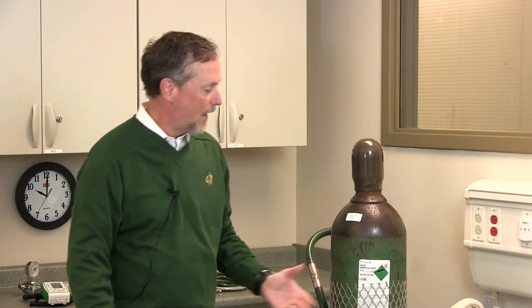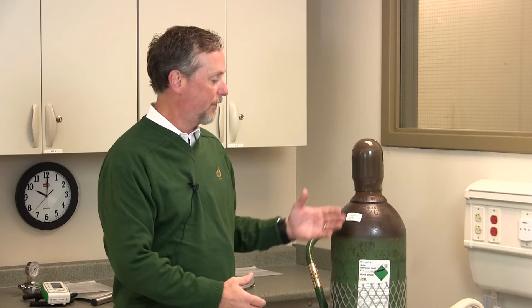So this is a Heliox tank. You can tell it's Heliox because universal colors are brown for helium and green for oxygen. One of the big things with the Heliox blender is we do make different versions. We make a high flow version, we make a low flow version. We make an 80-20 version and a 70-30 version.